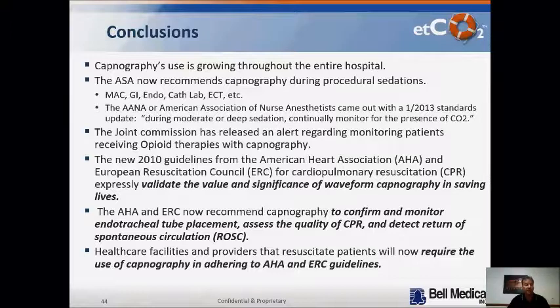Capnography's use is growing throughout the entire hospital. The ASA now recommends capnography during procedural sedations, MAC anesthesia, GI, endo, all those different cases. The American Association of Nurse Anesthetists came out in 2013 updating their standards to continually monitor the presence of CO2 during moderate or deep sedation. The Joint Commission released an alert regarding monitoring patients receiving opiate therapies with capnography. And in 2010, the American Heart Association recommended it for resuscitation. The American Heart Association and the Europeans also recommended capnography to confirm and monitor endotracheal tube placement and the quality of your CPR.